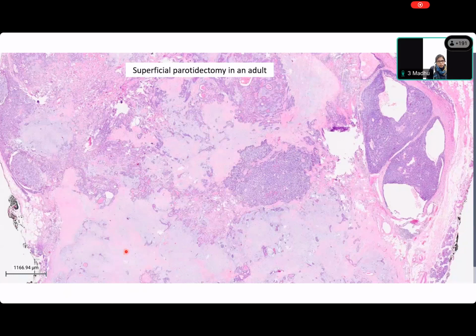Cells around the ducts. Now there is a chondromyxoid stroma. Please ask for annotation, because I do not see what it is that you are talking about. Ma'am, there is a variegated morphology and chondromyxoid stroma. Very good. What is this variegated morphology? Come on, Shivani. Ma'am, there's a difference in the different areas. So what is that morphology? You're seeing it, no? So please tell me.